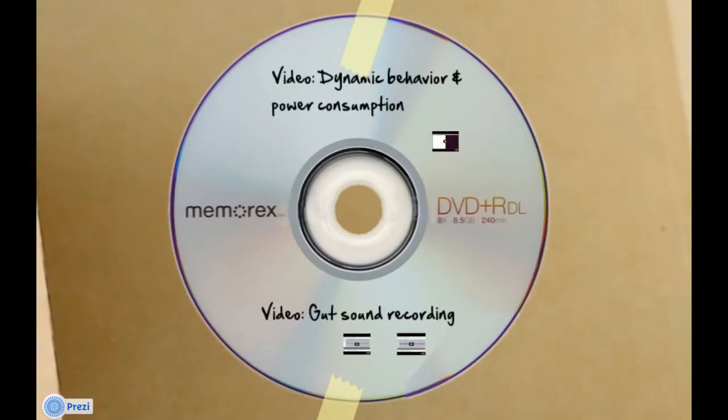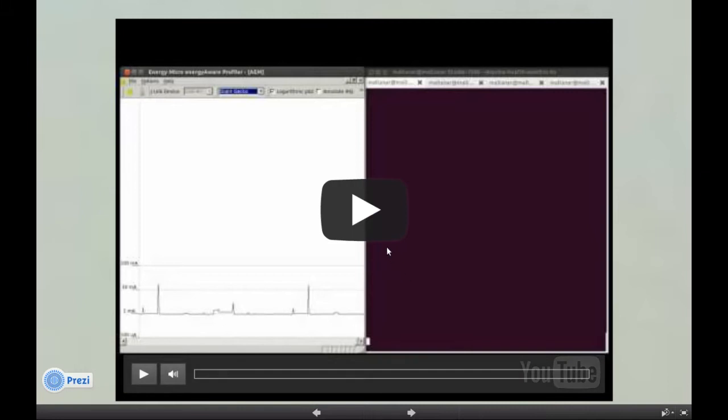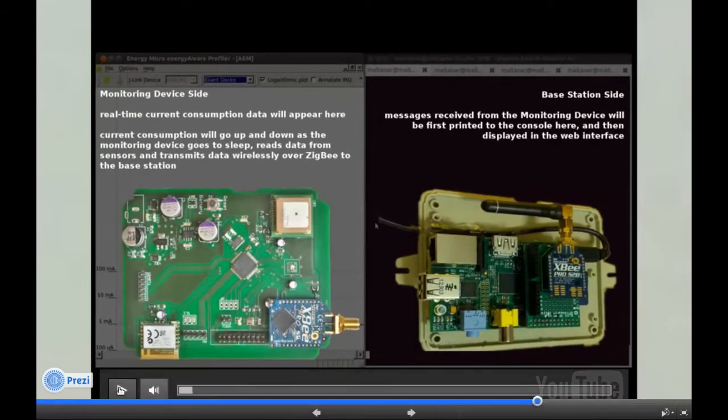This video shows a demonstration of the running system and how it was optimized for low power consumption. In the left frame, you will see the real-time current consumption of the monitoring device while it executes certain tasks. The right frame shows the console of the base station and displays how data is received and presented.